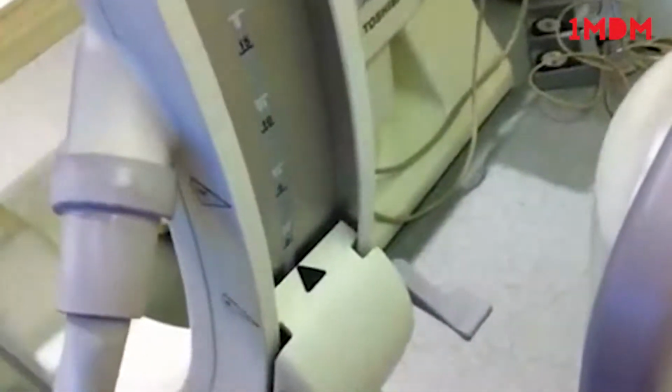Let me just get this machine back into the AP position, okay? So you release this lock right here, you pull up the C-arm. Of course I should have done this at the same time, so I can pull the machine back to avoid striking the table. Okay, let me just bring this back to 0 now. There we go. And I can raise up the C-arm.